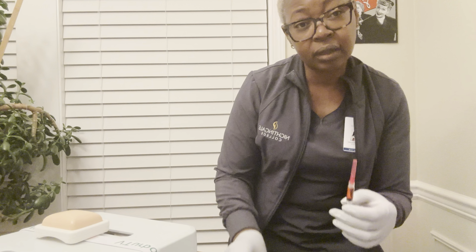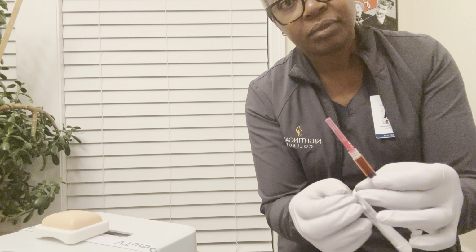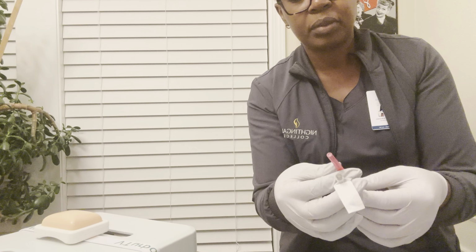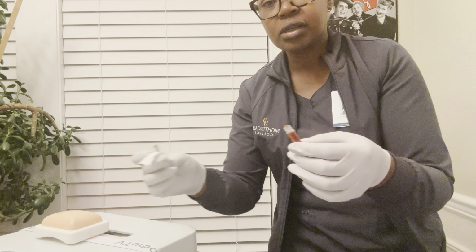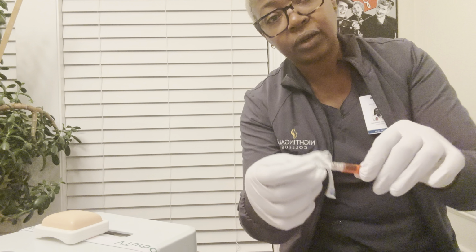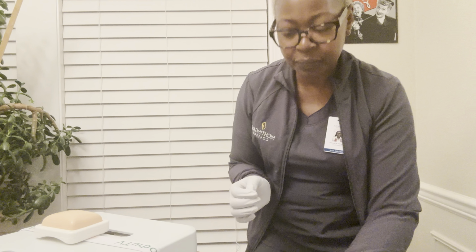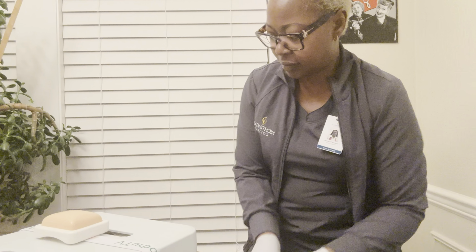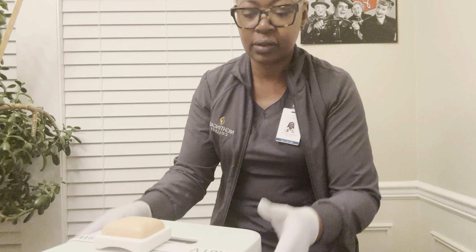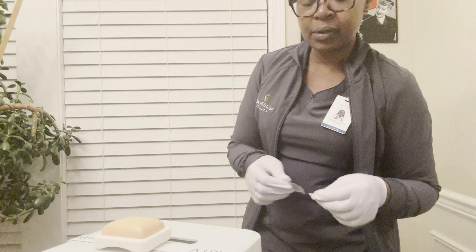Before then, let me open the needle that I'm going to be using. It's a 22 gauge needle that I'll be using to administer the medication. So I'll open up this. I'll put that in the sharps, and I will introduce the new needle. I'll leave it like that, set it down so that I can clean the area that I'll be injecting. Have this away. So I'm going to bring this closer to the camera. So I'll go ahead and clean the area that I'll be using.